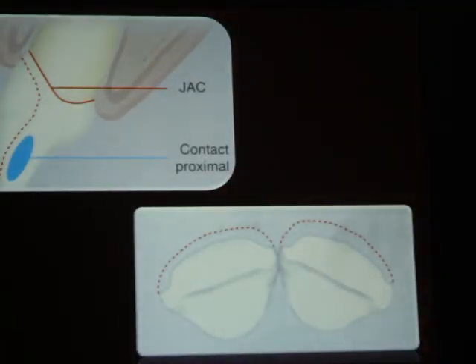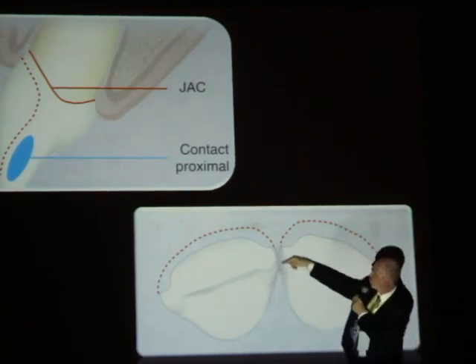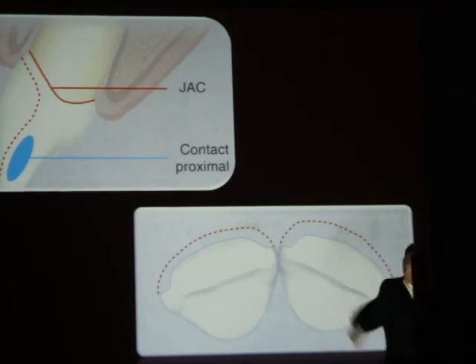So here, when you do your proximal preparations, you need to decide how much you need to go in lingual.